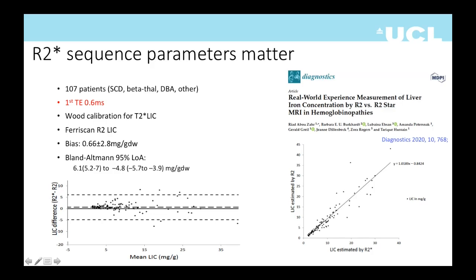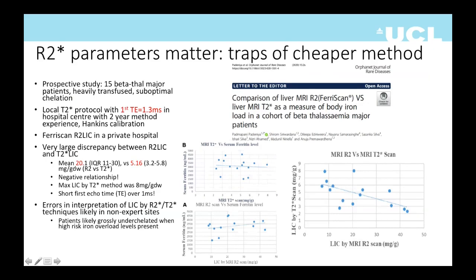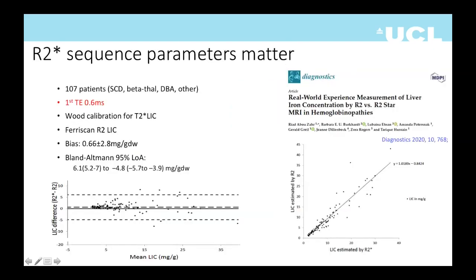In the study above, the bias was about 400%. Here, the bias is negligible. You can see that the correlation is positive and that the points lie mainly on the line of equivalence. But if you look at the limits of agreement, it's actually from 6 to -4, or with 95% confidence from 7 to -6. So if you have a result of 10, you actually don't know if the other method had a result of 5 or 17.